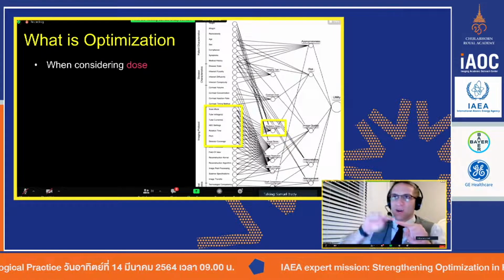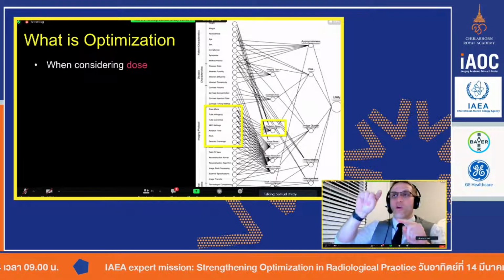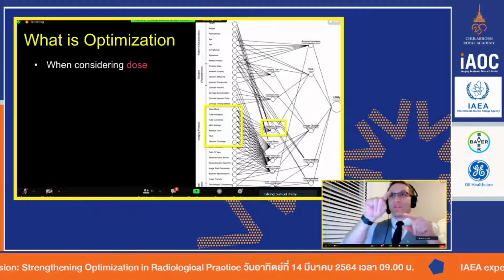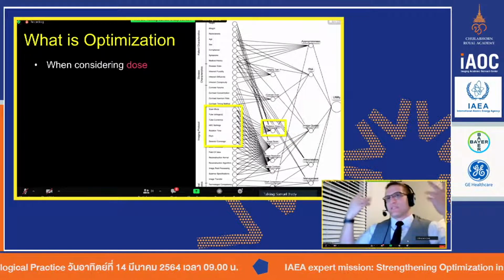And to get it to go up really quick, you either have to have a very low pitch so the system can modulate quickly, or you start at the bottom and you go up. And so it starts at the high dose, and a system could reduce the dose pretty quick. And so you can go normal dose, high dose down to low dose, and the system is perfectly fine doing that.